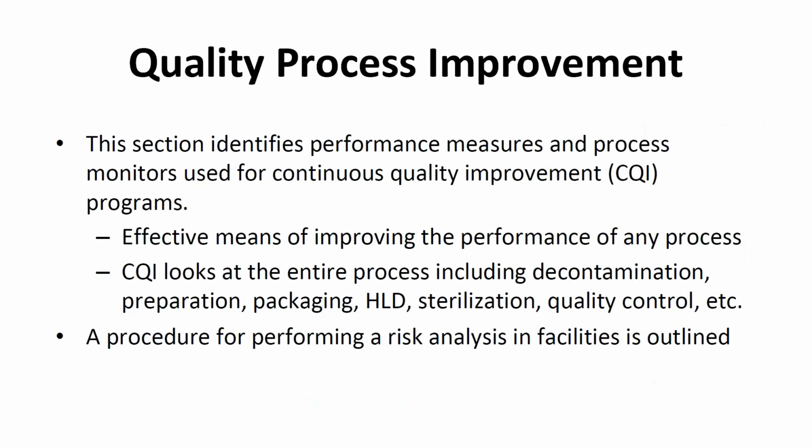There is also risk analysis information built into ST91 and how you can do a risk analysis around things like interval for storage of endoscopes, also known as hang time. So it's so important to me to stress to you to build quality into your process up front, before there is an issue, to ensure that we have the best outcome for our patients.